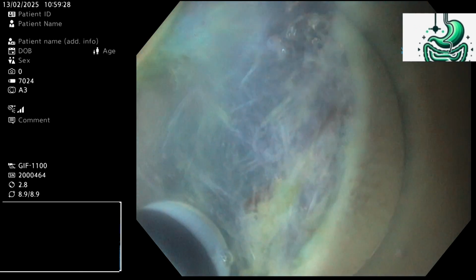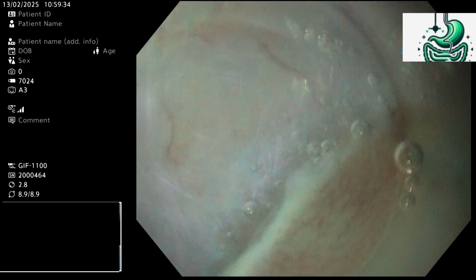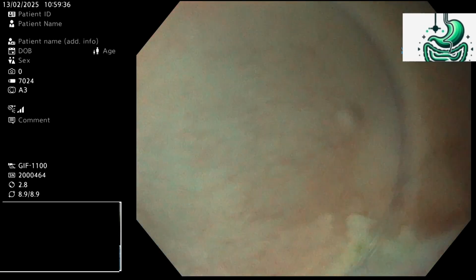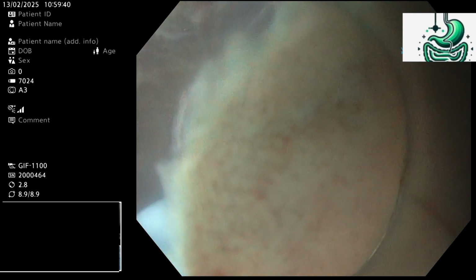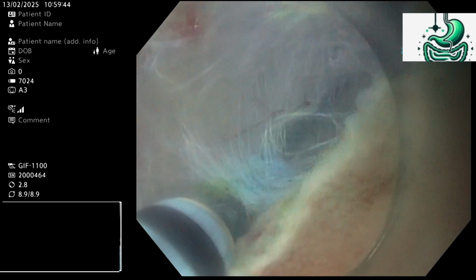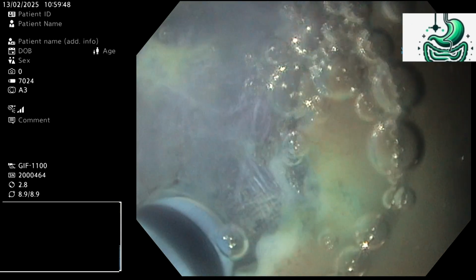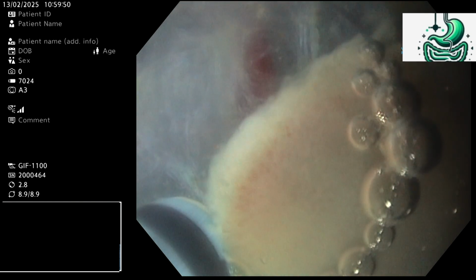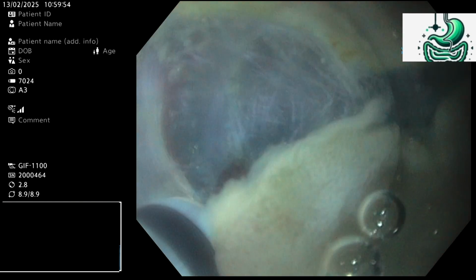Yes. Okay. Thank you. We had this similar discussion initially, because when we discussed strategy, I proposed my plan would have been distal approach, pocket, then circumferential incision, tunnel, and then open the pocket. So I see where you come from with your question.